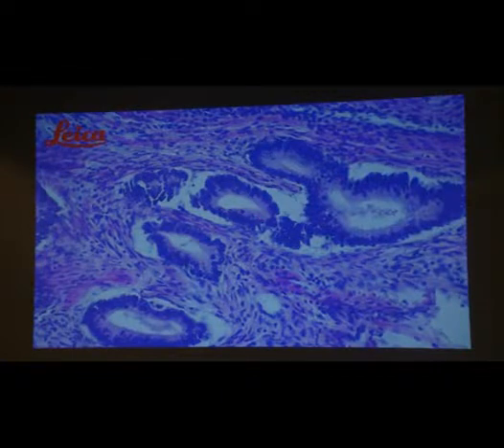But then if you see these mitotic figures and apoptotic bodies around the lumina, this is usual type, right? This is HPV associated, and it's very similar to the one in the other case.